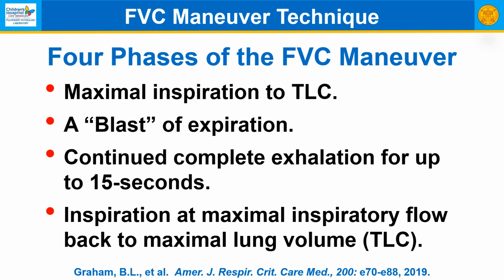Now there are four phases of the forced vital capacity maneuver in terms of making this a valid test. First, a maximal inspiration to total lung capacity. Second, a blast of exhalation. Third, continued complete exhalation for up to 15 seconds. And finally, inspiration at maximal inspiratory flow back to the maximal lung volume, or total lung capacity.